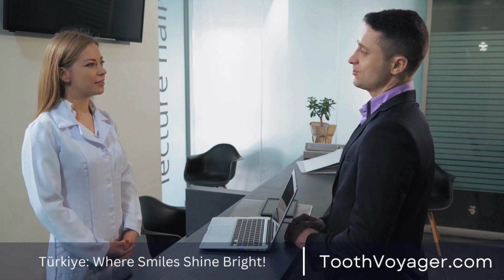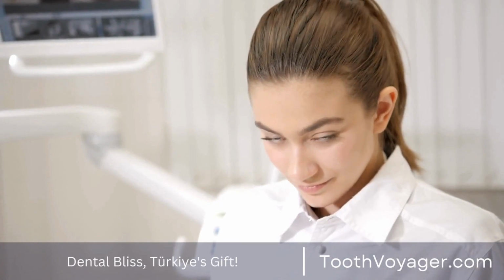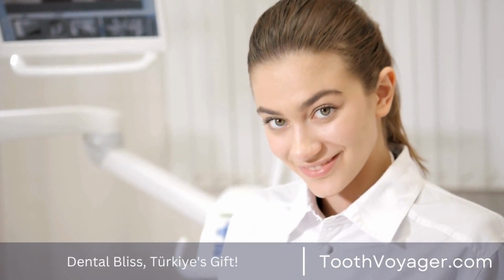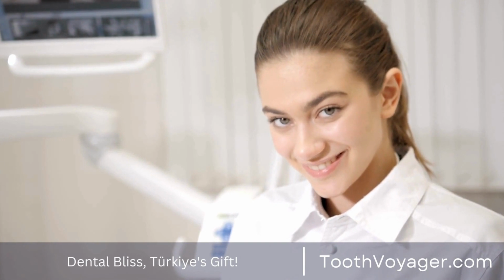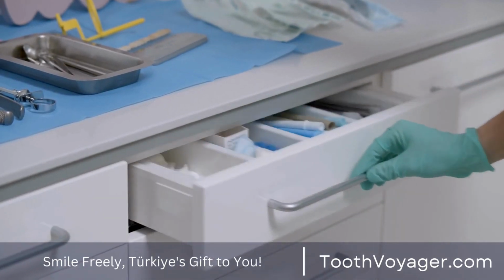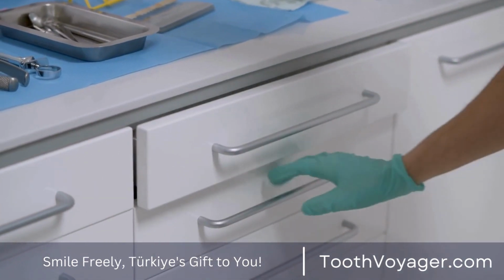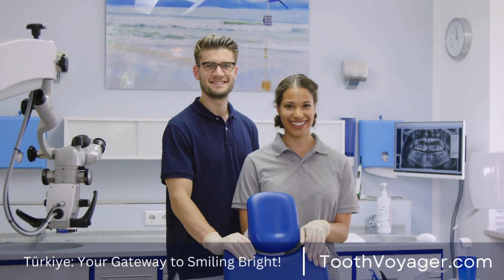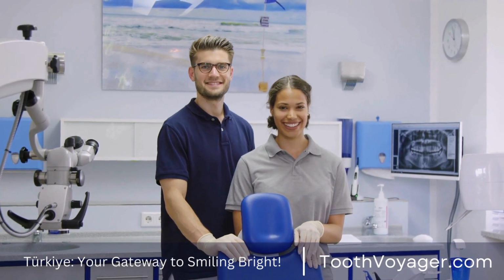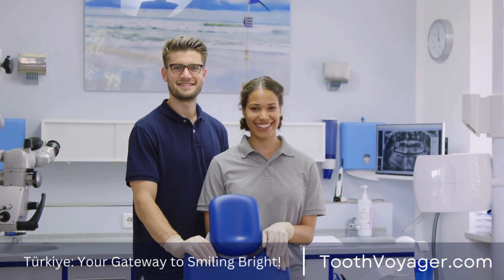In this period, patients may receive a temporary crown to fill in the space caused by the tooth that was lost. Final restoration. After the implant has completely repaired and bonded to the bone, the final restoration is able to be attached to the implant. It could involve the installation of a bridge, crown, or denture, based on the individual requirements of each patient.